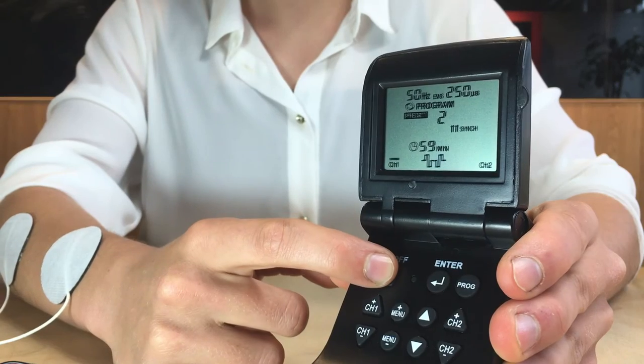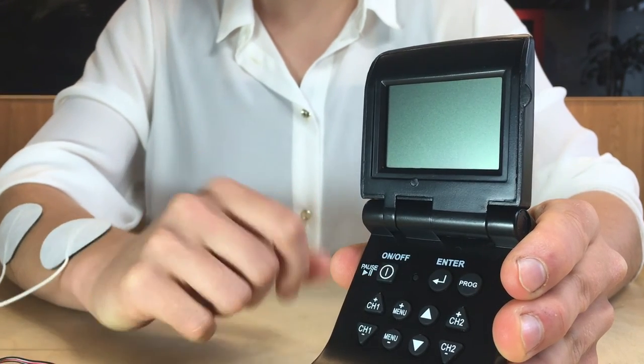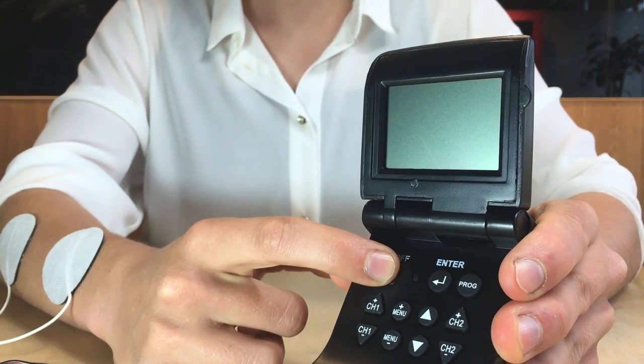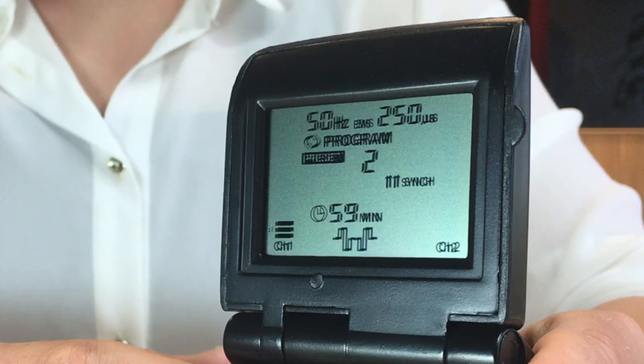Pressing and holding the On-Off button for three seconds will turn the device off. The machine has the benefit of a last program memory function, so when you next turn your device on, it will automatically start on the last program that you used. You will only need to adjust the intensity levels that you want for Channel 1 and Channel 2.